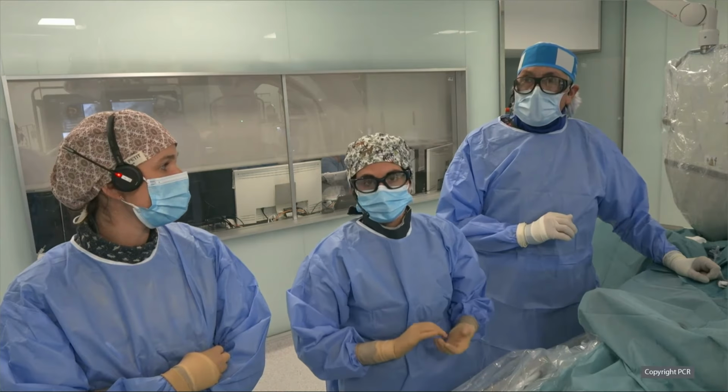Look at the left, you can see what will be the trajectory of the rotational atherectomy, certainly leaving untouched the calcific nodule. And at the right, you can see the distinct benefit of orbital atherectomy, that is that when you're performing backward sanding, something you cannot perform with rotational atherectomy, you will be addressing this nodule and will be able to be effective.